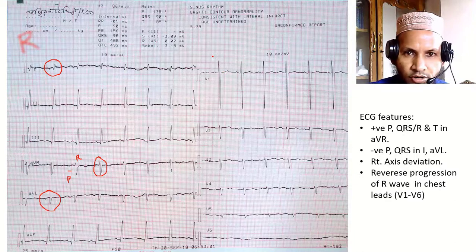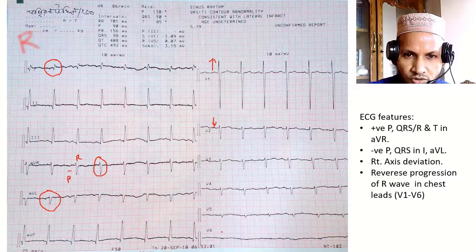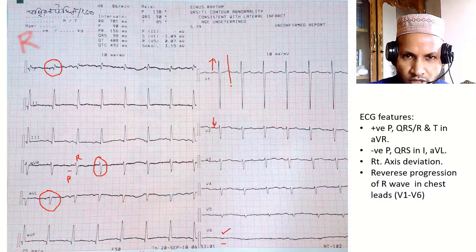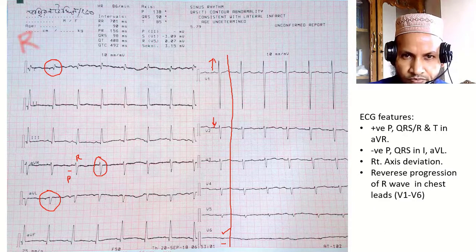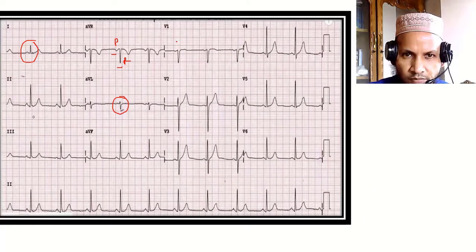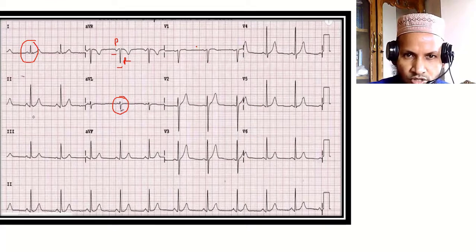The next feature to look at is the progression of the R wave in the precordial leads V1 to V6. Here the height of the R wave is progressively decreasing from V1 to V6, and in lead V6 there is virtually no R wave — this is called reverse R wave progression. In a normal ECG, the R wave is virtually absent in V1 and gradually increases in amplitude from V1 to V6 or V5 — this is normal progression.